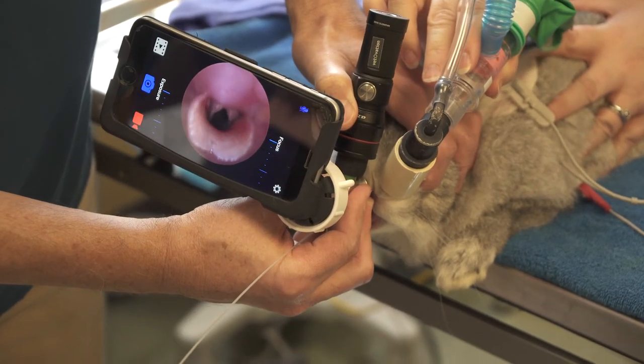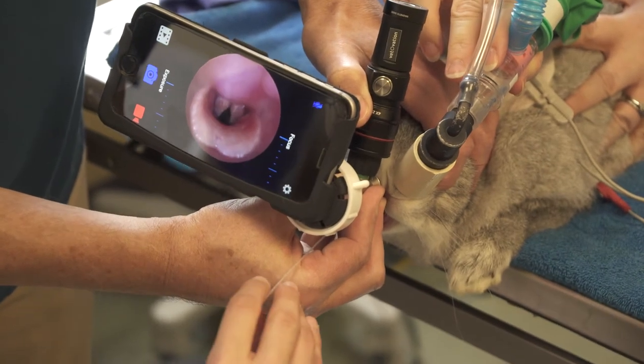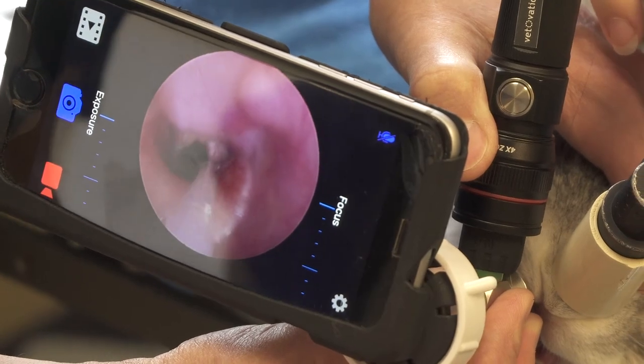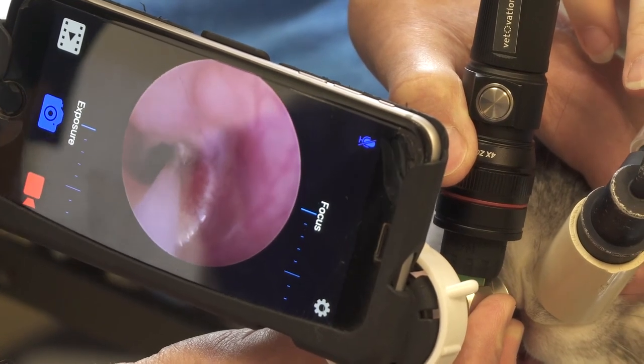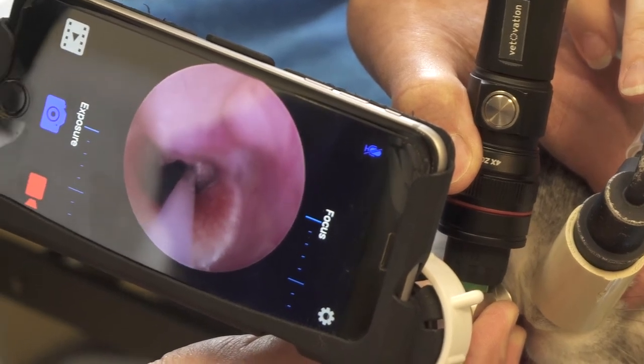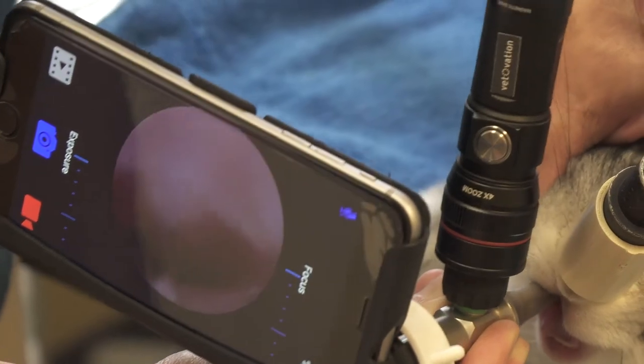I'm going to have Angela pass our catheter slowly — go ahead and pass our catheter. Start to advance that and direct it right in for me. Are we sure we're in? Let's make sure it goes in. Good. Go on in. Now hold it in place. I'm going to back out. Keep holding. That's right — keep holding. Now I'm going to go back in and confirm that it's still in place. It is. Go ahead and pass that.